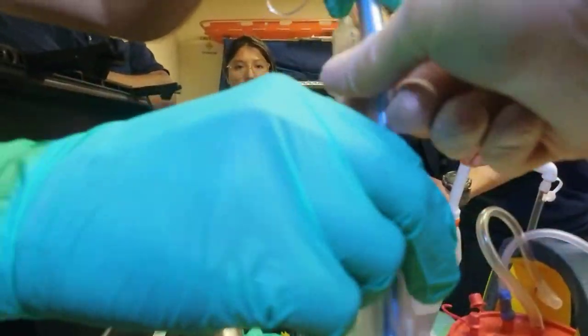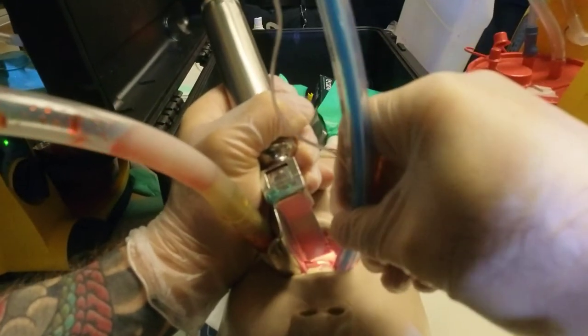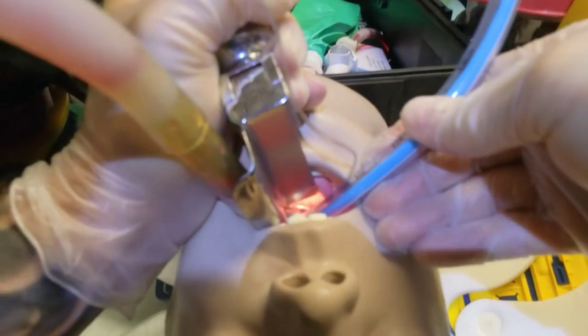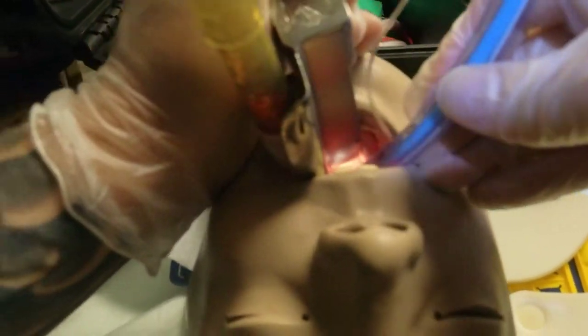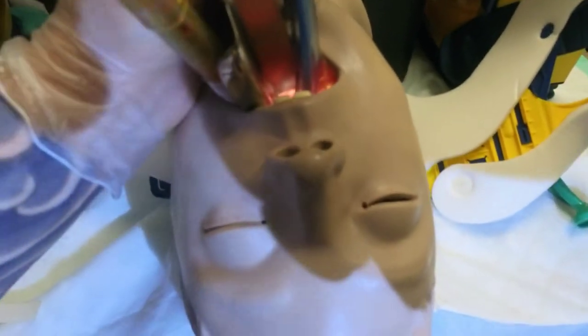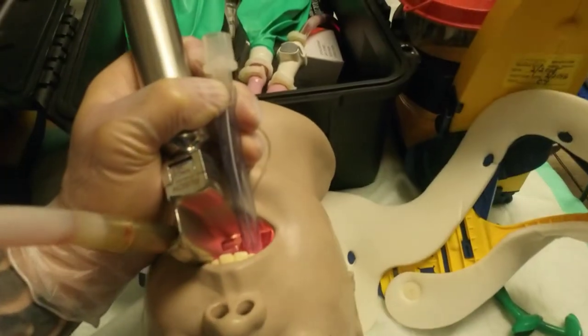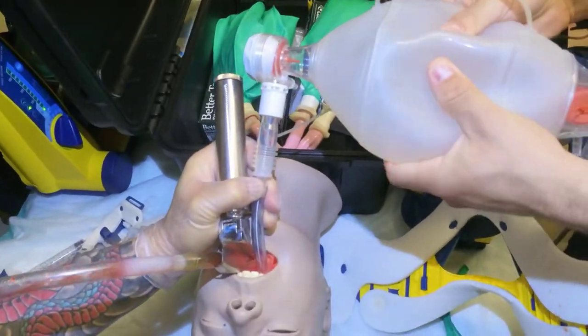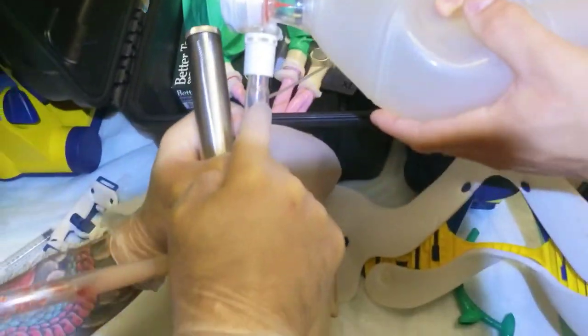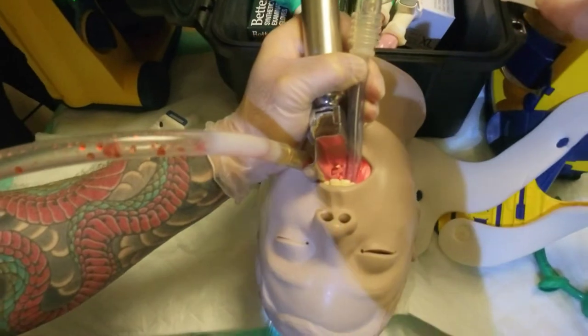Make sure you don't grab the cuff — grab here — and my partner takes the tube. Remember, if I have resistance, I pull back and rotate. At 8.5 tube size, I have 24 to 25 at the lip line. I hold the tube, partner inflates the cuff. My blade stays in place because I want to make sure it's positioned correctly. Then I remove the bougie, and my partner connects the BVM with end-tidal CO2. We confirm: good chest rise, end-tidal CO2, lung sounds bilateral, SpO2. You can see the lungs are inflating.